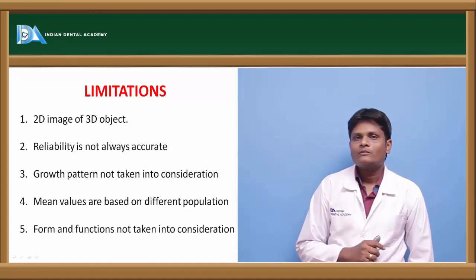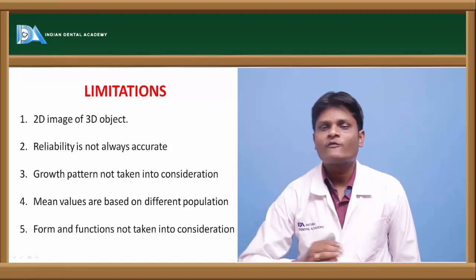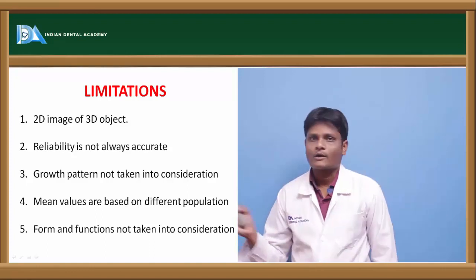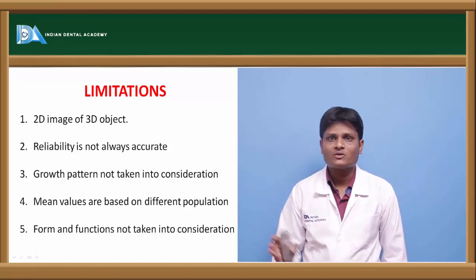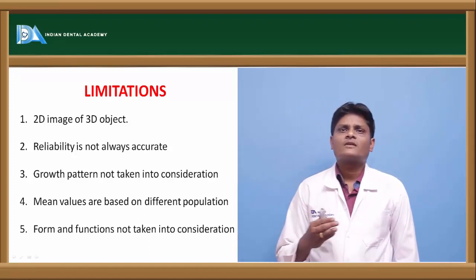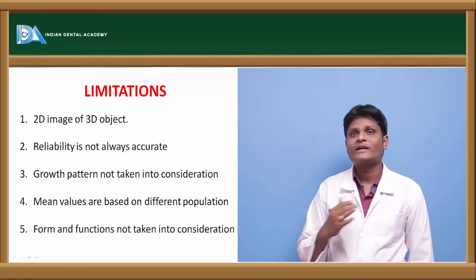Now, the form and functions of the various craniofacial skeletal structures are not taken into consideration in the different analyses that were proposed on the lateral cephalogram. So these are the major limitations of cephalometrics and cephalometric analysis.